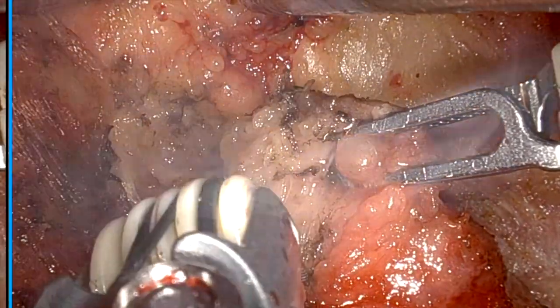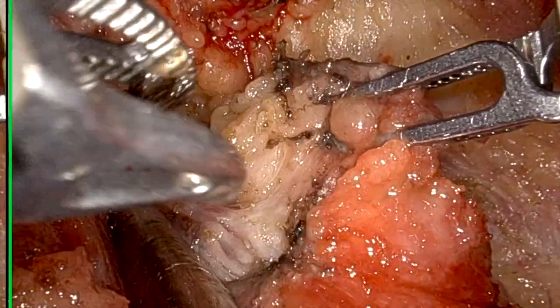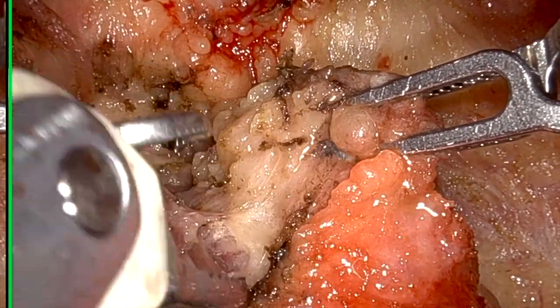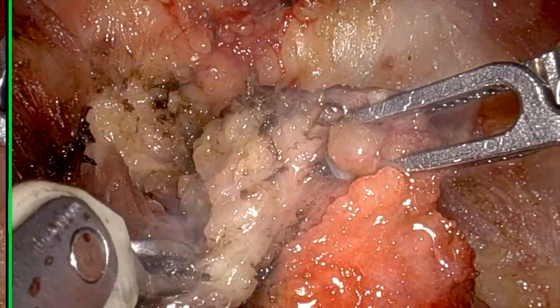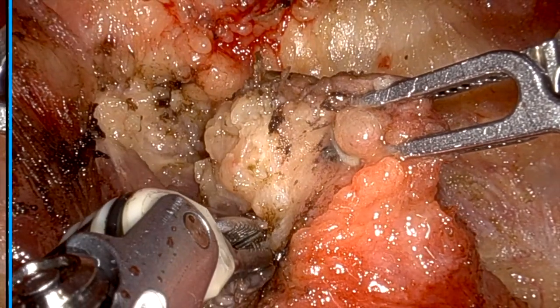This retroauricular approach of robotic neck dissection was developed in 2012 by Lee and his colleagues from South Korea. It is also called the modified facelift approach. Why have I chosen the retroauricular approach in this case? We have other approaches as well, but why retroauricular approach?